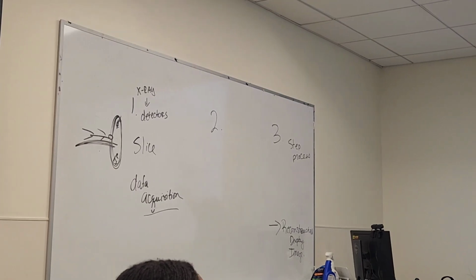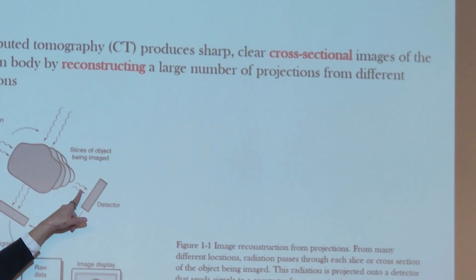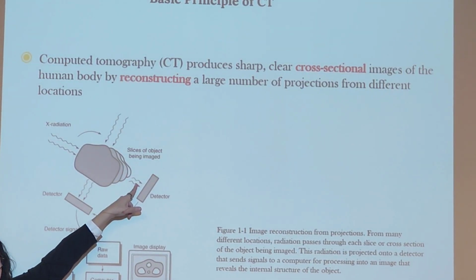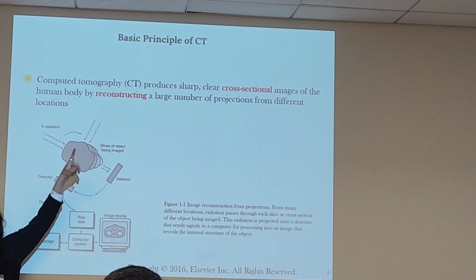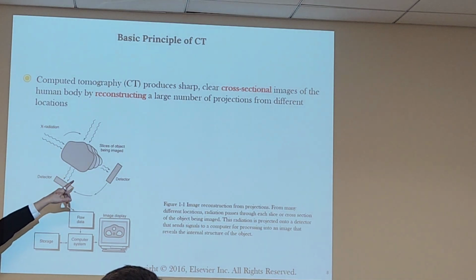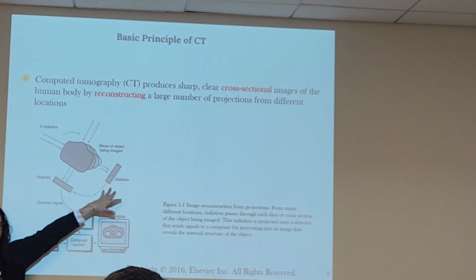Here, we know what these squiggly lines mean. They're in waveform. Humor me. What are these symbols? You've seen them throughout your physics and principles of radiation exposure. X-rays. Yeah, X-rays, because X-rays travel in waveform, right? Good. So as X-ray is being emitted, it's landing onto the detectors, right? This drawing or that drawing, whichever one helps you. So X-rays are landing on the detectors. They are aimed purposely.